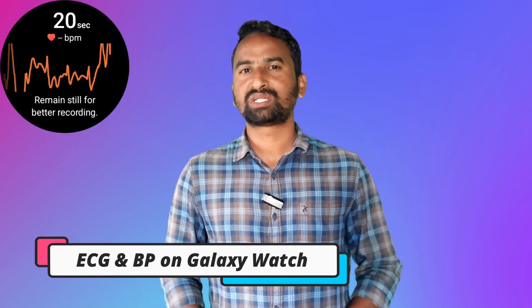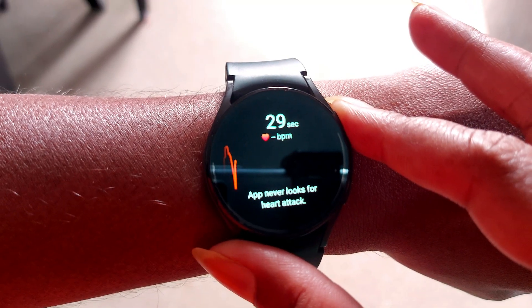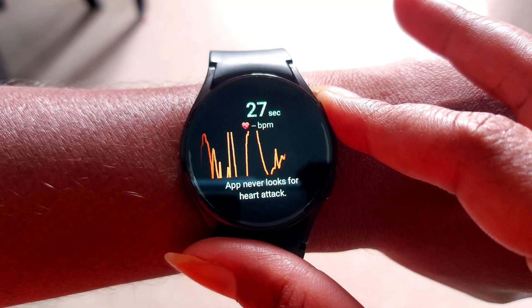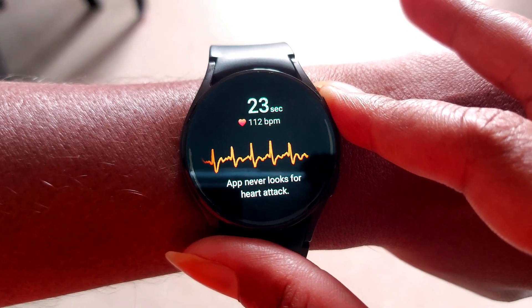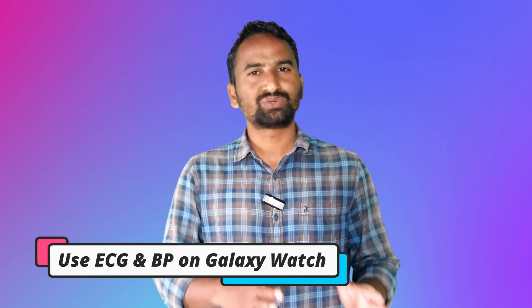In this video I will tell you how to use ECG and BP functions on your new Galaxy Watch. ECG and BP functions are not available in every country, and these functions are not available for non-Samsung phones. But don't worry — there is a way to use these functions in non-supported countries.